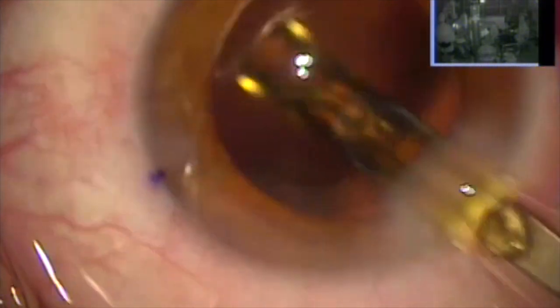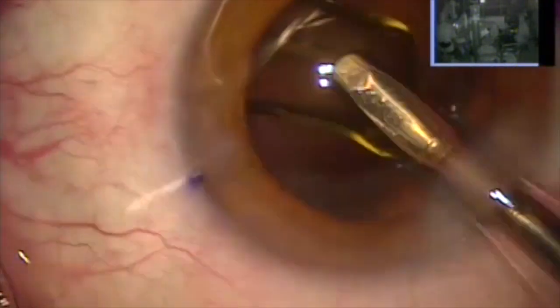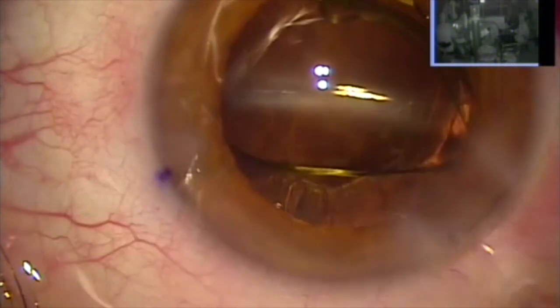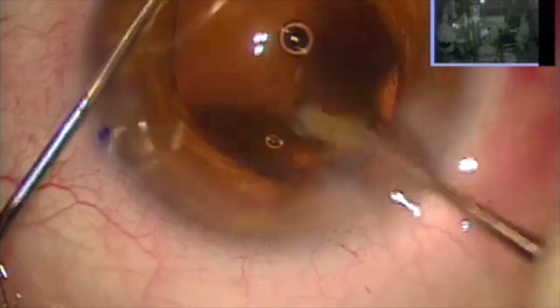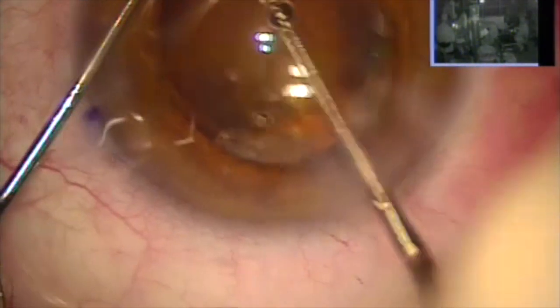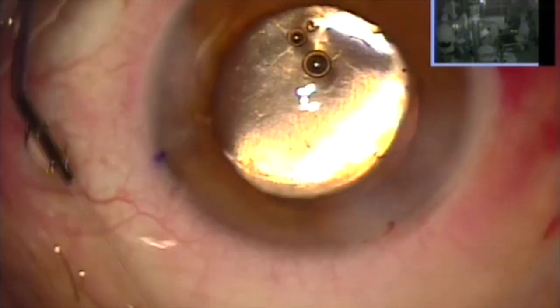The important thing here is I want to make sure that when the lens is placed in, I'm not pushing on the capsule bag and tearing the superior or injector-side portion of the bag. So I'm very careful. I'm pushing the lens down gently to have it unfold in the bag, and then very carefully, with the Kuglen and the Sinski hook, rotate the lens to the desired axis.